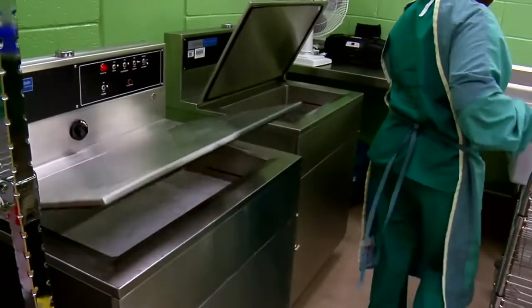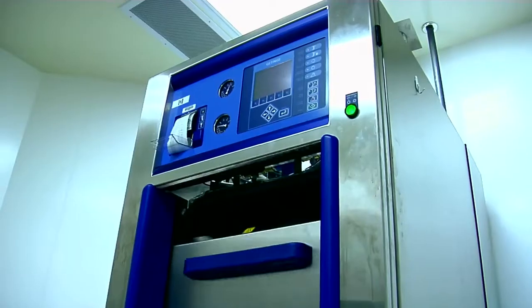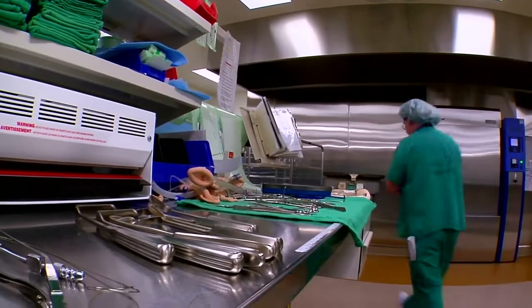It's more than just soap and water. You need to be trained in the high-tech aseptic equipment that decontaminates, sterilizes, and readies the tools for the trade.